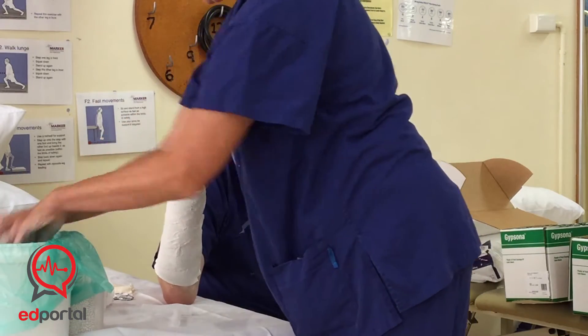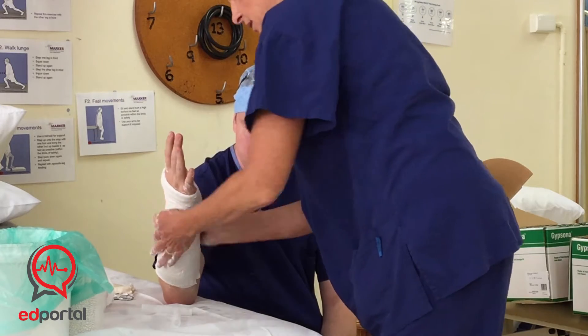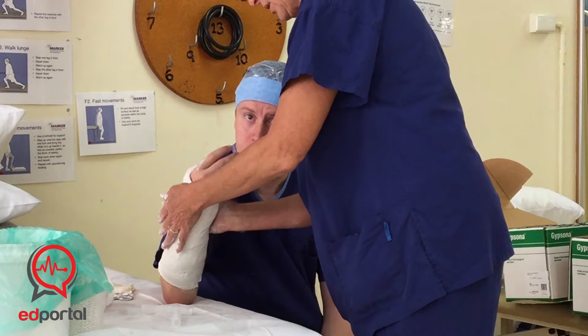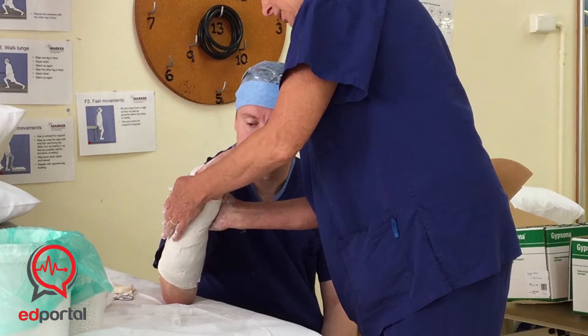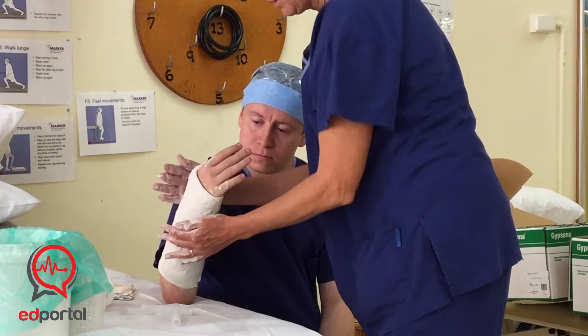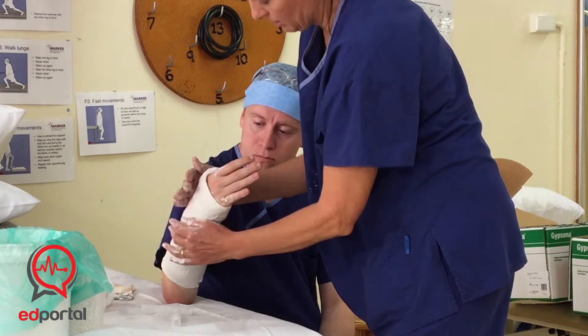You can wet your hands and do a neck roll with that. If you want to mould it, now is the time. For a Colles cast, you're going to have about 15 degrees of dorsiflexion and 20 degrees of ulnar deviation.